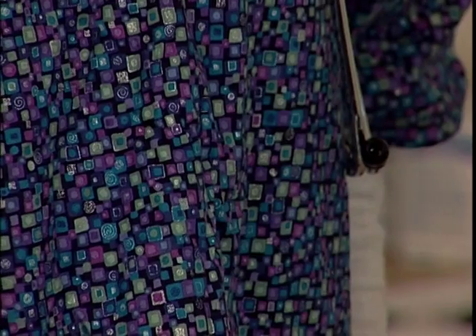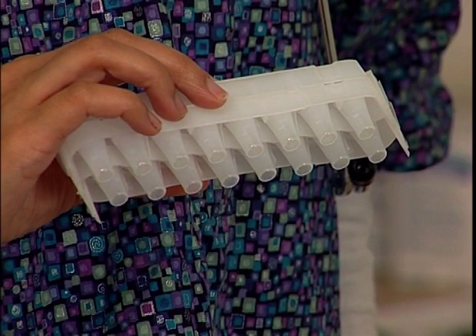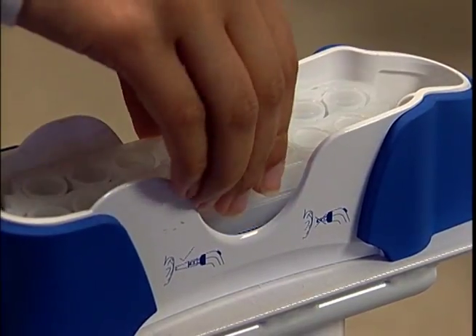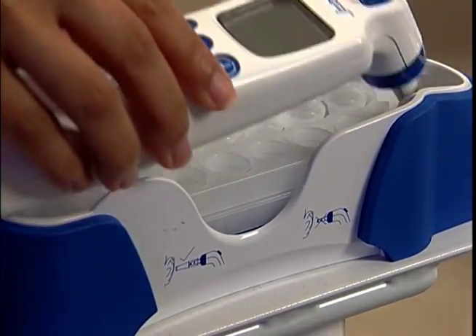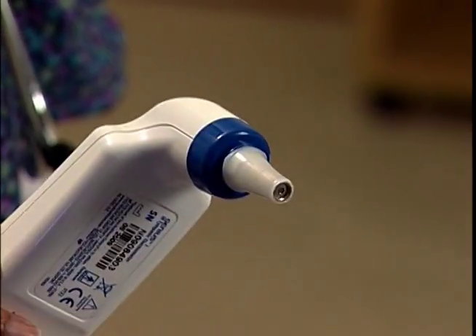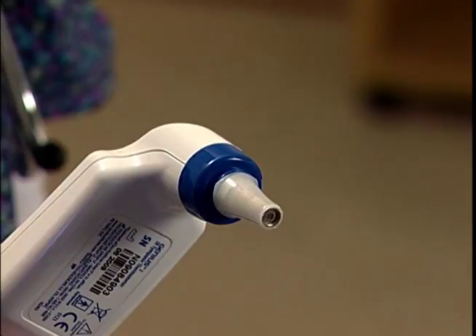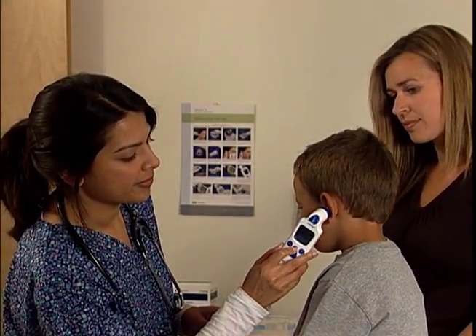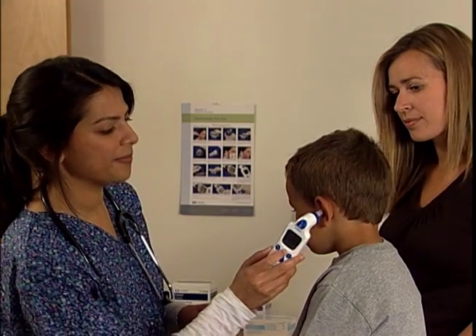To begin operation, install two cassettes of 16 probe covers and slide them smoothly into the base unit without touching or tearing the protective film on the tip of the probe cover. The Genius 2 will only operate when a new probe cover is installed for each use. The use of a new probe cover for each reading will guard against the possibility of cross-contamination and inaccurate temperatures.